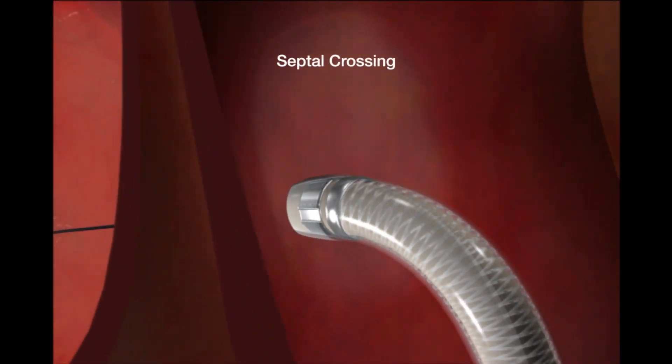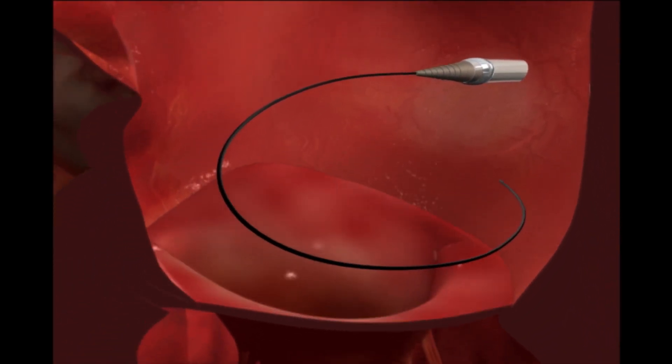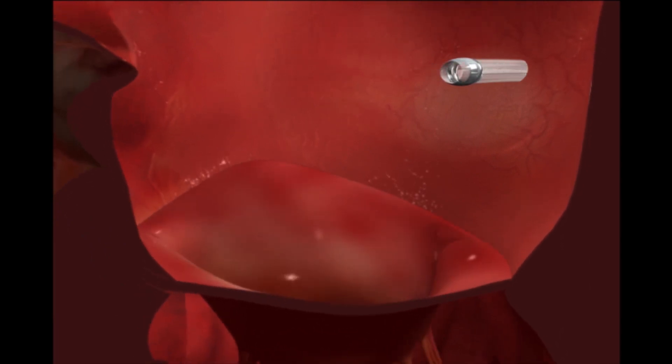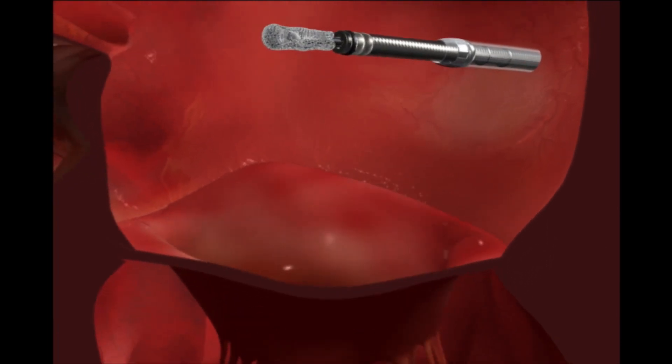The dilator is used to gradually advance the guide into the left atrium. The guide wire and dilator are then removed. The clip is gradually introduced into the left atrium.